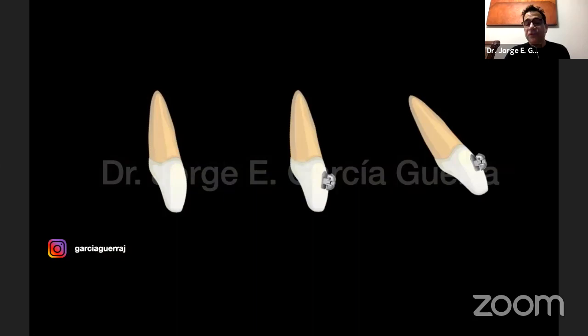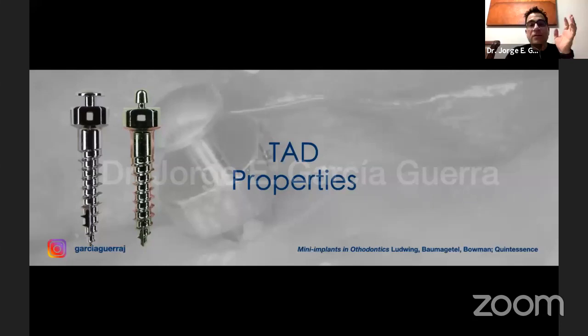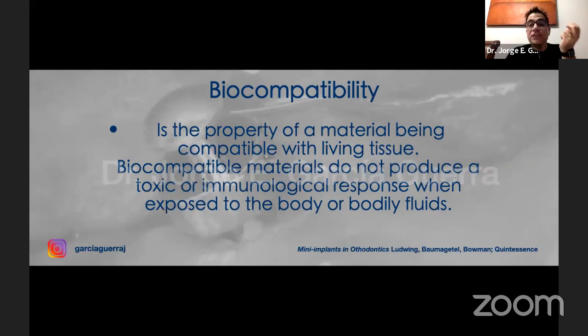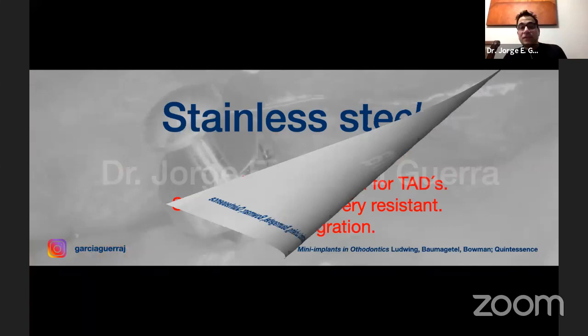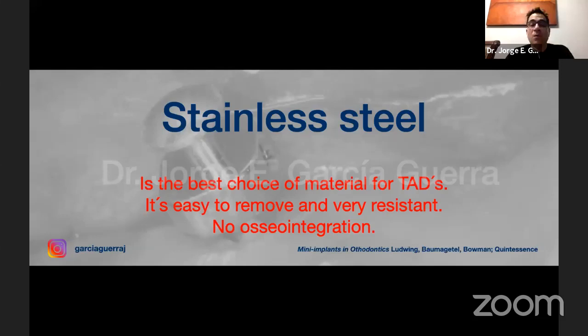Now we're going to talk a little bit about some properties of the temporary anchorage devices. First of all, as with everything that we use in the mouth of our patients, it has to have biocompatibility, okay? This means that the materials we're using don't produce any allergic or toxic reaction in our patients. This is very important because we are going to insert the mini screws in bone and in soft tissue. Now, the majority of the mini implants that we use are made of stainless steel. This is very important so we don't have osseointegration, and it's a more resistant material. It's also going to be easier to remove because we don't have osseointegration in these cases, okay?